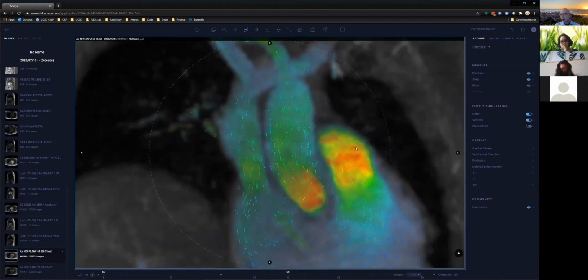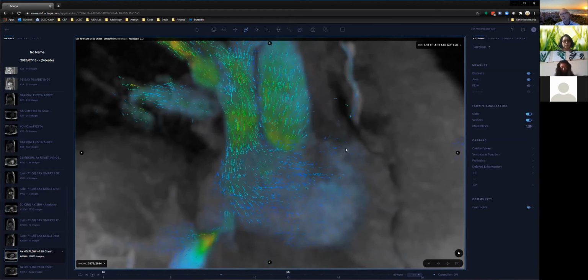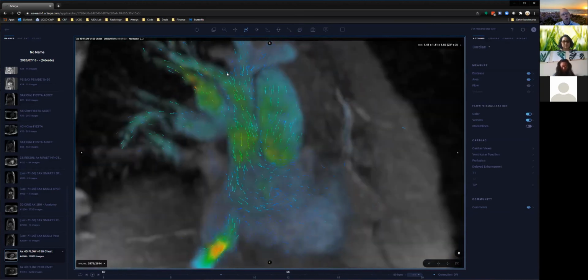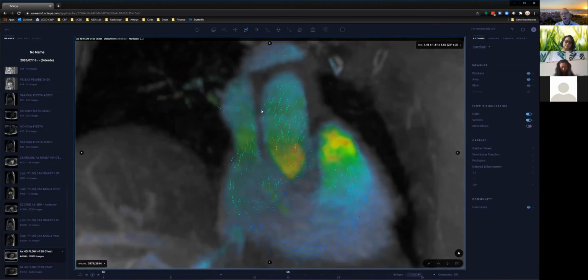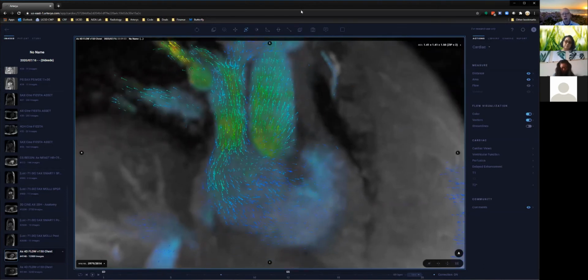I know Misha, who's here on the line and helped remind me to share my screen, helped me write a paper a number of years ago where we brought together about 10 cases from each of 4 different institutions, and as a resident, he measured the QPQS using a number of different measurements, and I'll show you what those are like.